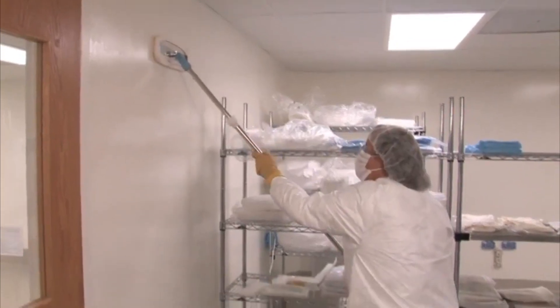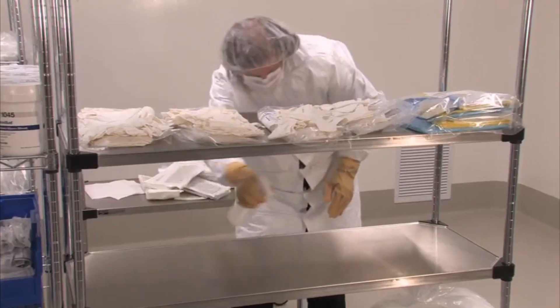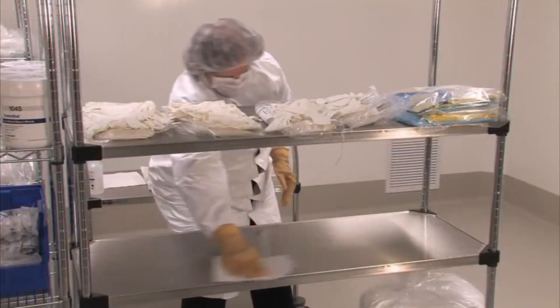Walls and ceilings must be cleaned monthly. Storage shelving should be cleaned at least monthly, removing every item and cleaning the shelves thoroughly before returning items to their bins.